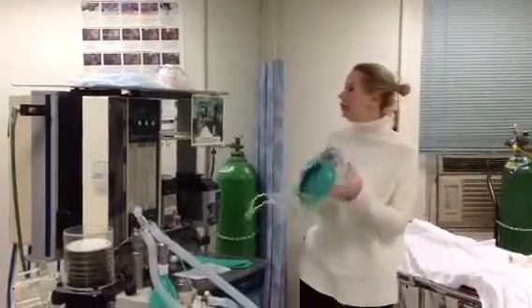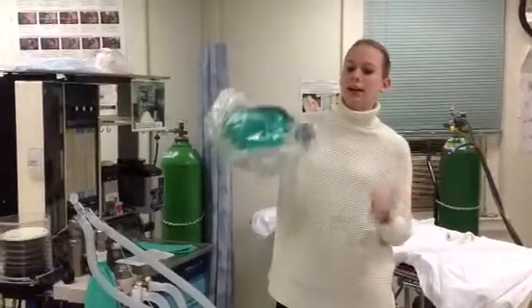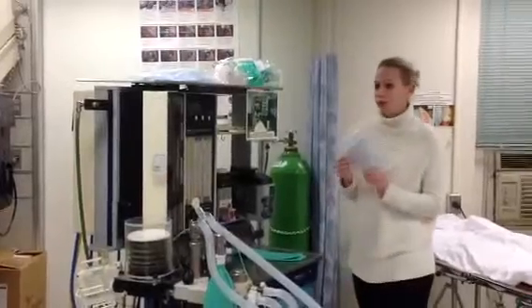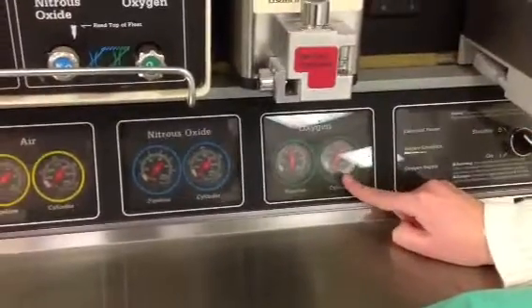Check your backup ventilation and ensure that it works. So make sure that it can hold pressure this way, and that it delivers air. Second, you're going to check your O2 cylinder in the back. You take your key, go to the O2 tank, turn to the right real quick, and then close. Go back to the front of the machine and make sure it reads 1,000 or greater, meaning the tank is half full.